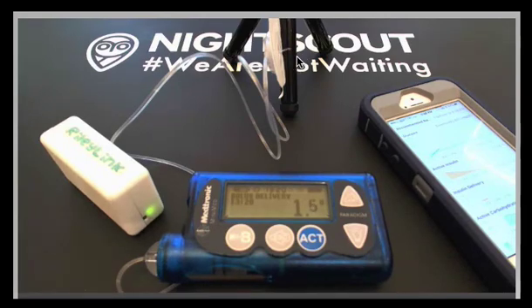This is the proof of concept for the remote bolus. This is a closed loop. Much more to be done. Thank you.